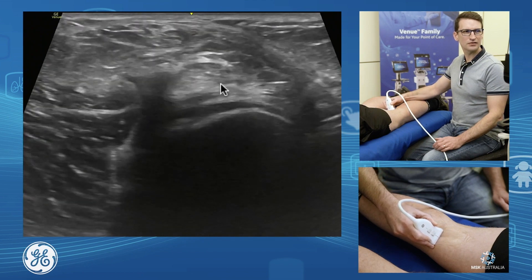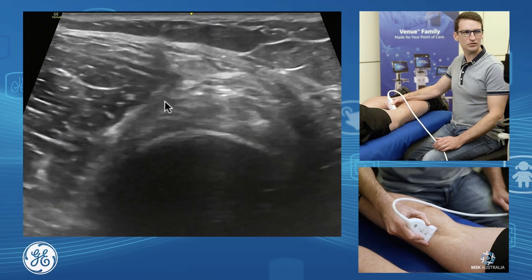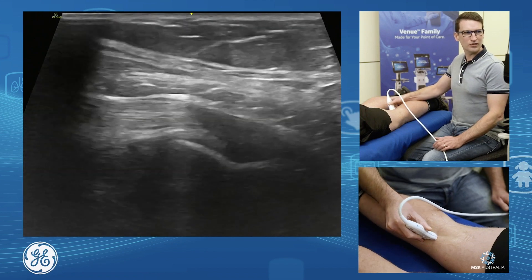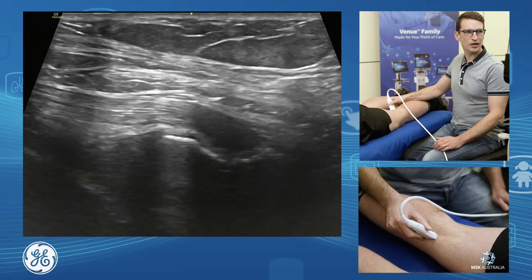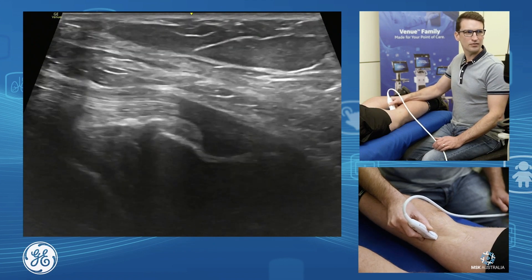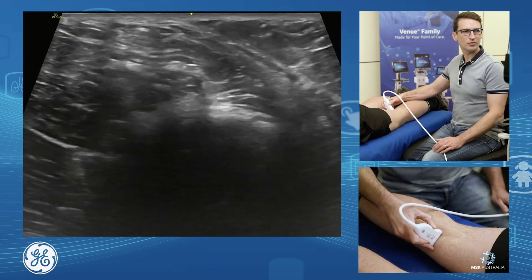We can see there, continuing down, that's our semi-membranous and semi-tendinous tendons. Our semi-membranous comes down and inserts onto our tibial plateau. It's got a direct arm which comes straight on. It's not a very nice tendon to scan because it actually has five separate arms, all shooting off in different directions, so we can sometimes pick up a bit of anisotropy and irregularity there. That's our semi-membranous coming back into short axis and coming back up.